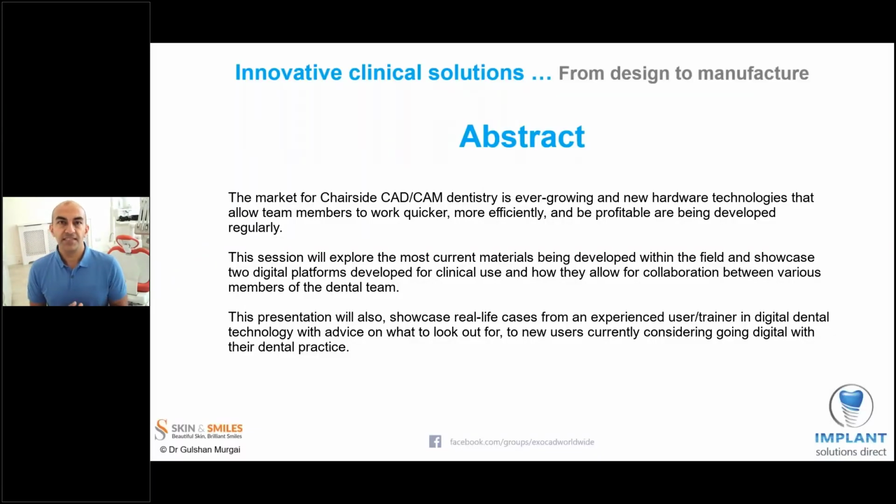So we're talking here today about innovative clinical solutions, and we're going to look at two different software platforms, both from the exocad company. exocad is very well known for its 10-year history in providing laboratory-based software for computer-aided design and manufacture. And what we're going to look at is products that have been released by the exocad company in the last few years that enable clinical innovations.